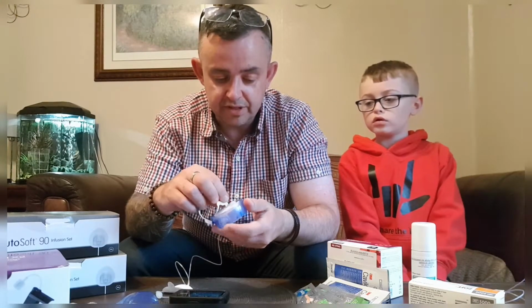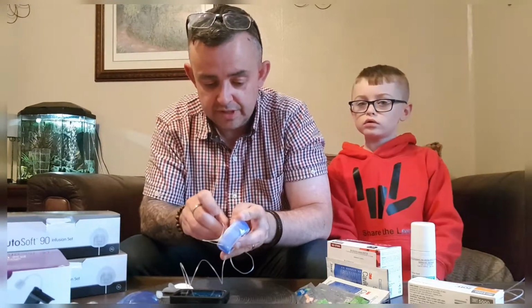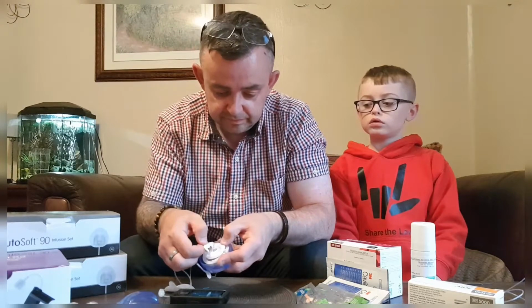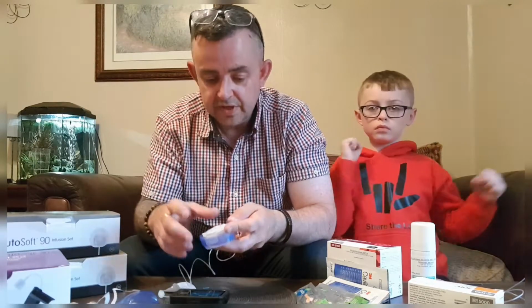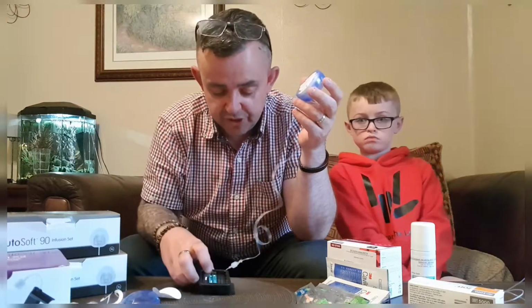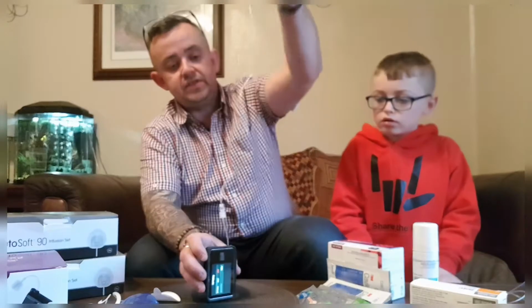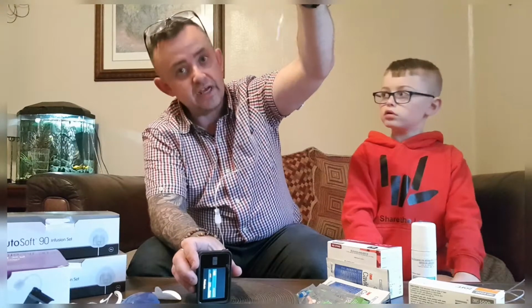They can be a little bit temperamental, like this one's been. So I just pop that on there. There we go. So, fill tubing. What we need to do now is this has to stand on its end, and we have to press start. This can take a few seconds. It just sucks the insulin in, about 12 units. Now if you look very carefully, you can see it going in.